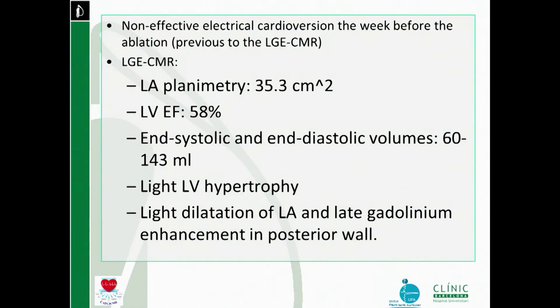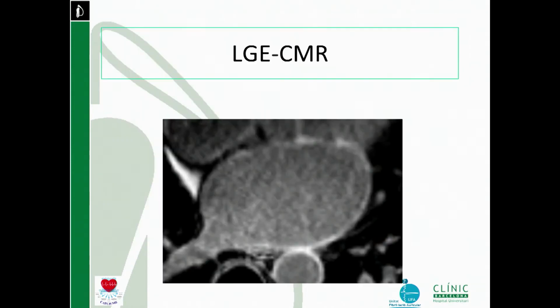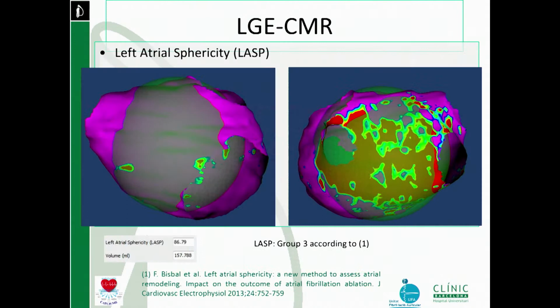And when you look at the MRI, you will see that this, first of all, is very spherical. So it's not very large, but very spherical and deformed. It's almost a sphere. This is why we also measure the sphericity, a concept we showed also, how close it is to a spheric shape. It tells you how sick the atrium is.